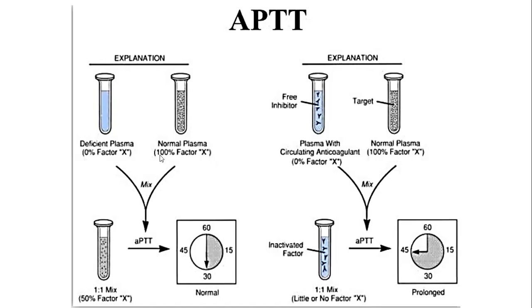May normal siya nga concentration of clotting factors. Let's say we test for the deficiency sa clotting factor 10. Okay? So let's say ang samples ng pasyente, we try to think lang tanay, base deficient sa clotting factor 10.